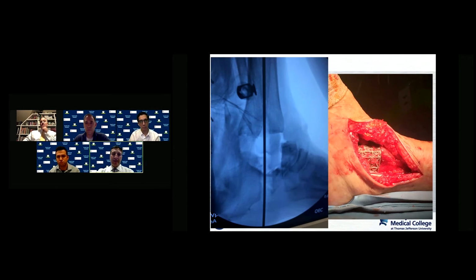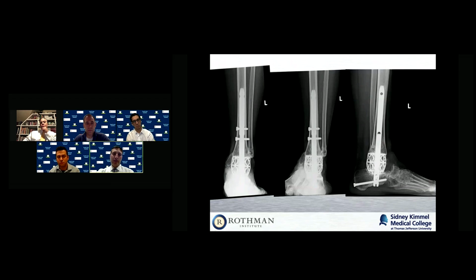So coming up on here, this is an intraoperative picture, again, a different cage case, just to give you the idea. Those sizers that I showed you before, there are 3 sizes that go along with it, and it's cored out centrally so you can ream safely without violating your final implant. Once you get your appropriate diameter reamed, put your final implant in, and that's what you see on the right with good bone-on-bone apposition.